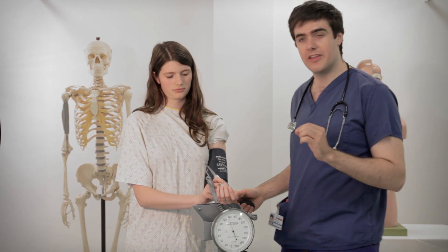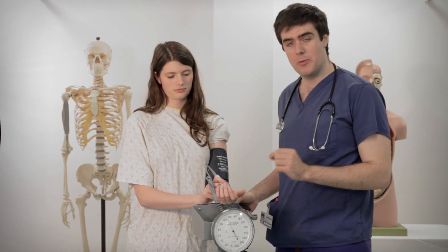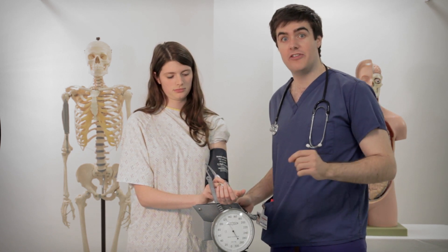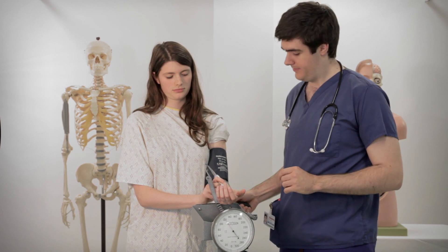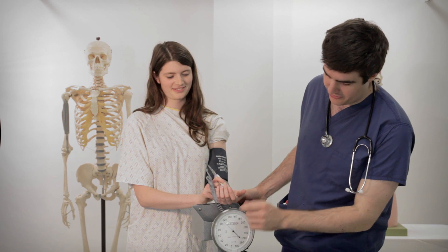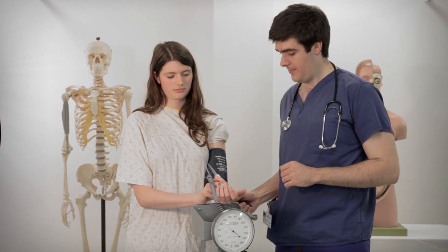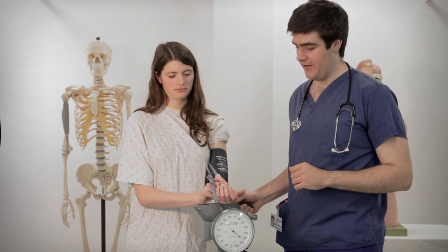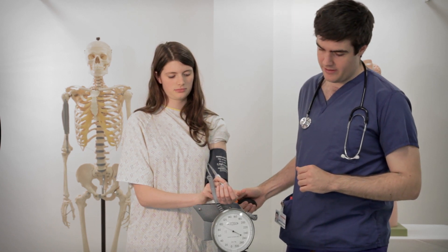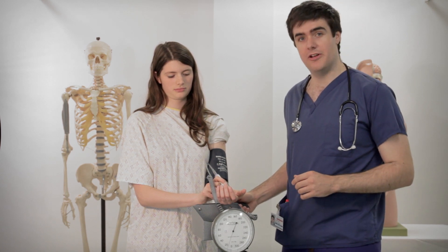I'm now going to let air slowly out of the cuff so that it releases the pressure and the blood can flow back. When we start hearing the noises again that's her systolic blood pressure. And that happened at just under 120, at about 116. I can carry on letting air out of the cuff, and you can hear that her pulse has now completely returned.